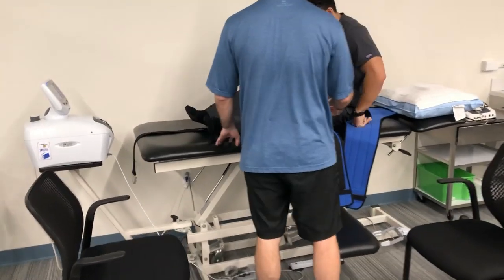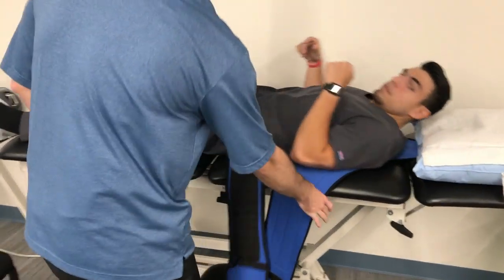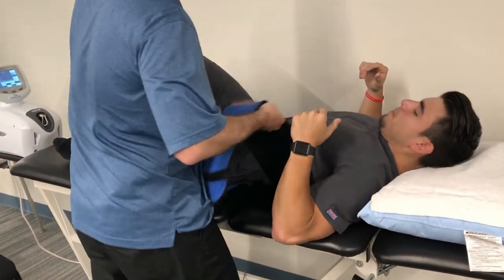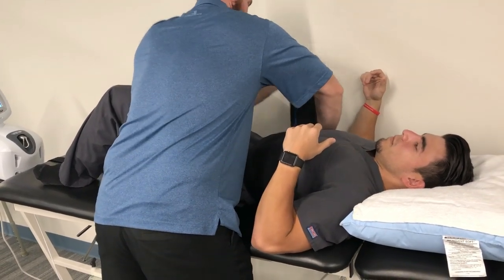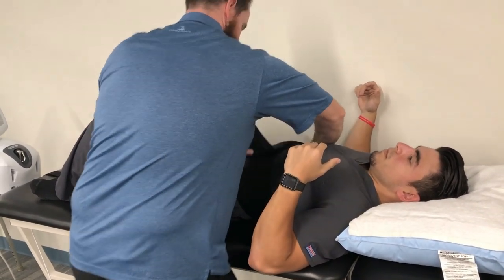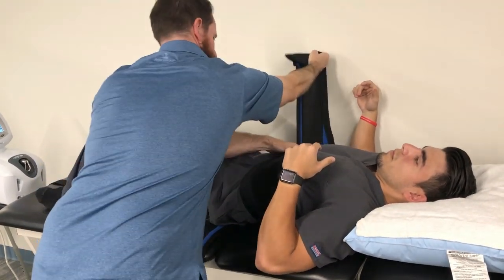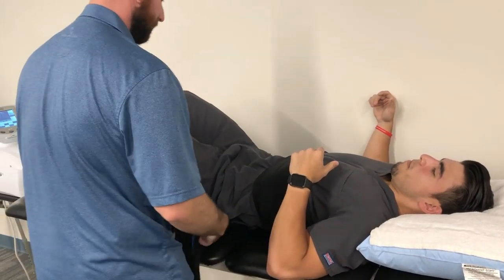So we'll get you set up so that this is right around your lumbar spine. Okay. I want this nice and tight, but not too uncomfortable. So how does that feel right there? It's fine. Feel tight?